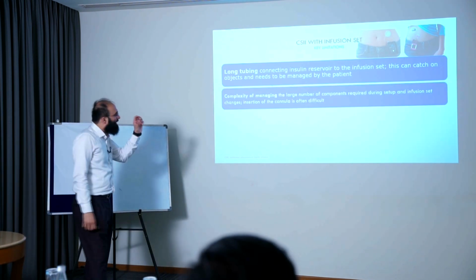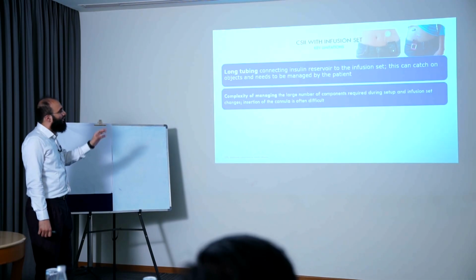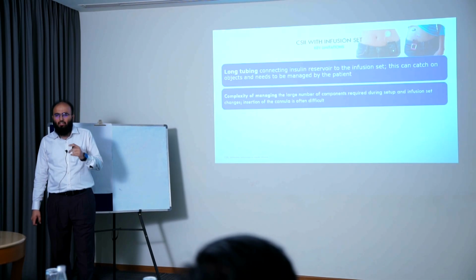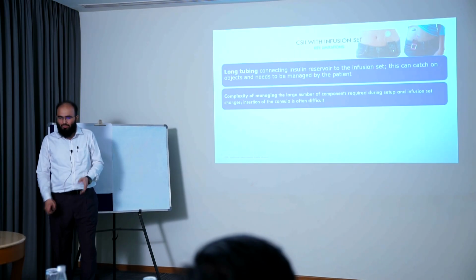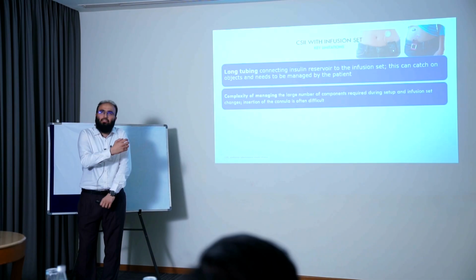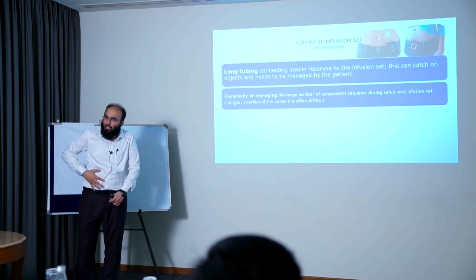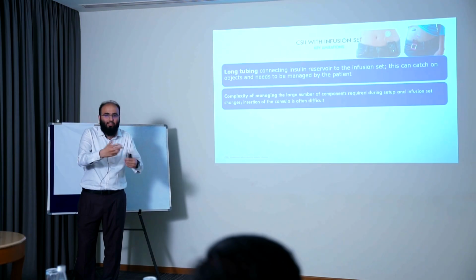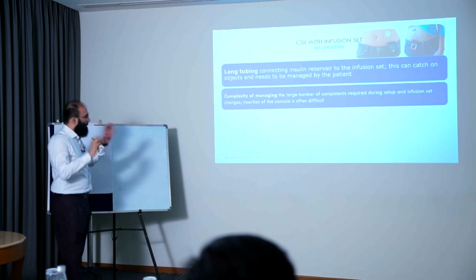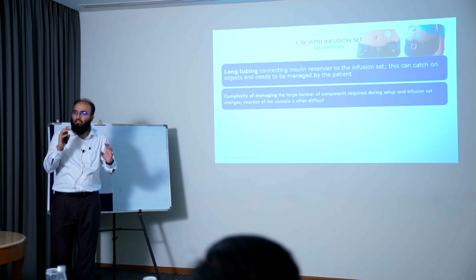without kinking and all. Complexity of managing the large number of components required during setup and infusion set changes; insertion of the cannula is often difficult. Patient might find it really difficult. Elderly patients especially, कि एक सेंसर लगाना है and सेंसर को फिर ट्रांसमीटर को चार्ज करके उसको कनेक्ट करना है, एक कैन्युला लगाना है, रिजर्वॉयर चेंज करना है 2 दिन में, things like that, ट्यूबिंग चेंज करनी है, etc. So it is a little complex, but it is definitely doable.